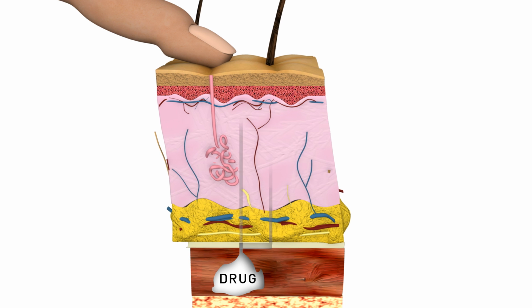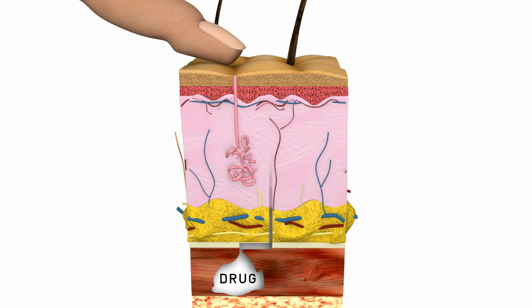After the time lapse, the skin is released as the needle is withdrawn. This ensures that the skin closes over the injection site, preventing leakage onto the skin.